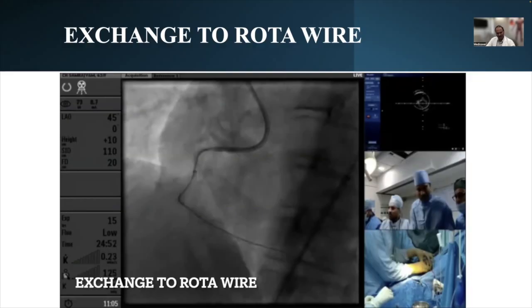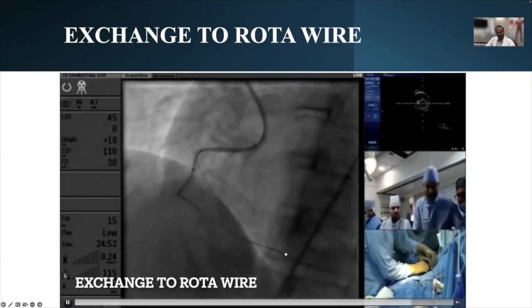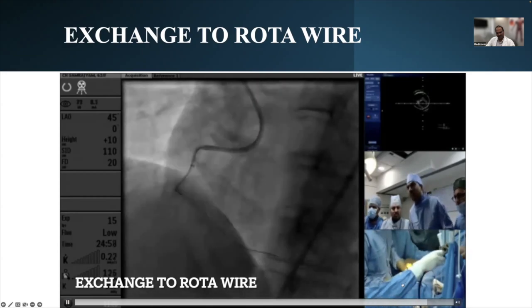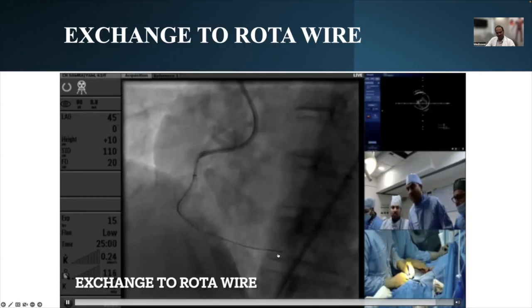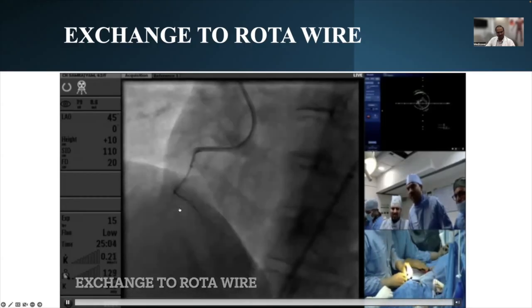So you have to do all of this on wire extensions. Controlling your dock extension is key while removing Corsair. You can see here, with the dock extension, we are just removing Corsair.